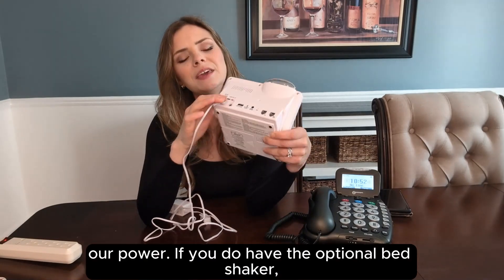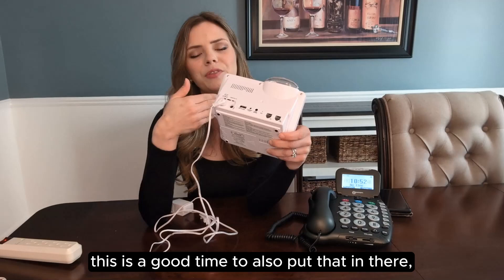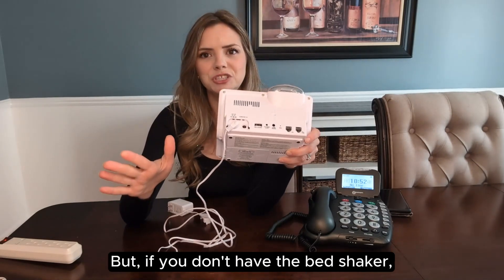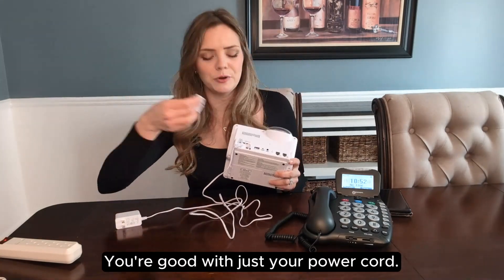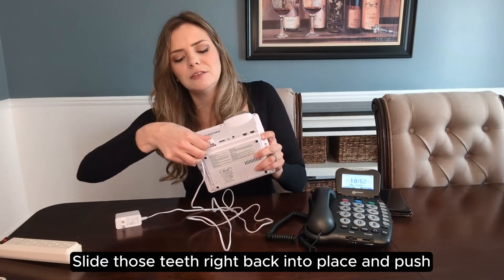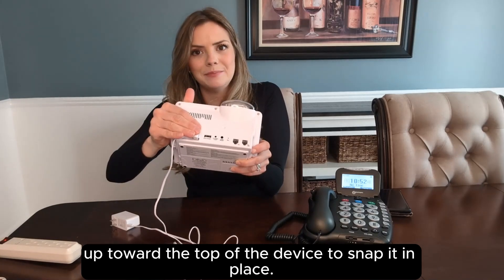If you do have the optional bed shaker, this is a good time to also put that in while you have the cover off — it's this larger port right here. But if you don't have the bed shaker, that's fine. You're good with just your power cord. We're going to put the cover back on, slide those teeth right back into place, and push up toward the top of the device to snap it in place.